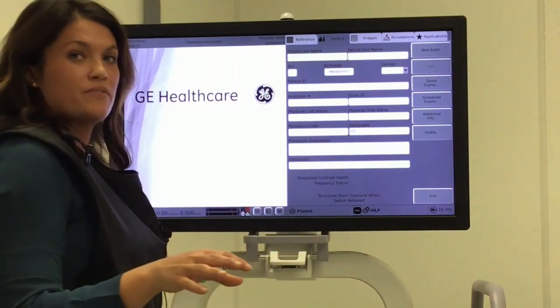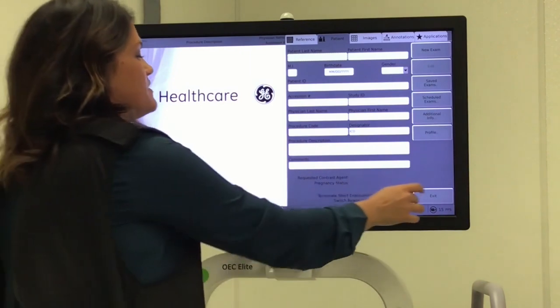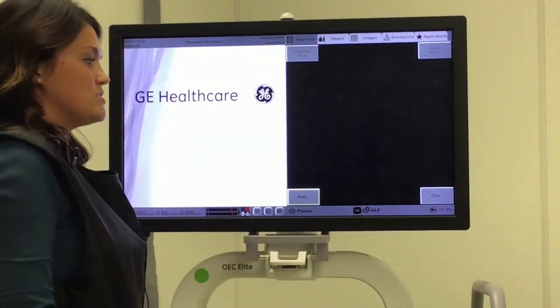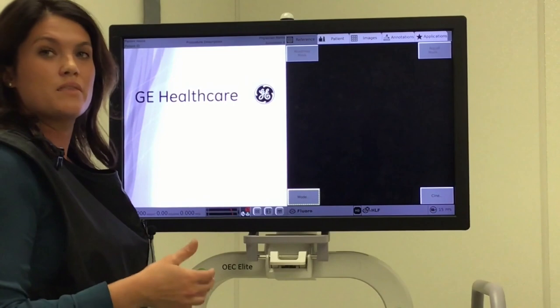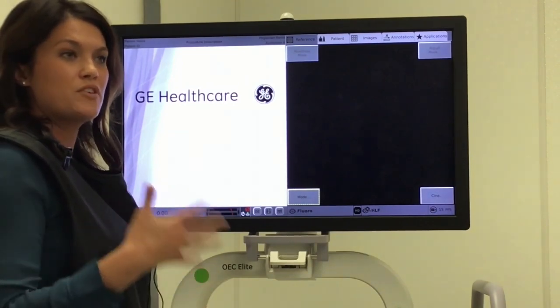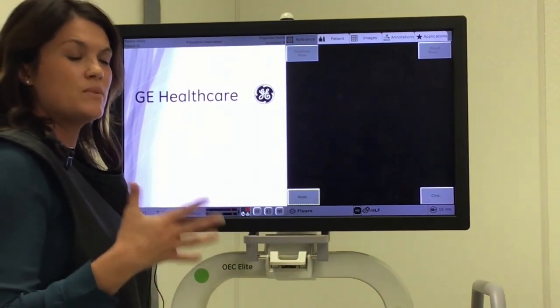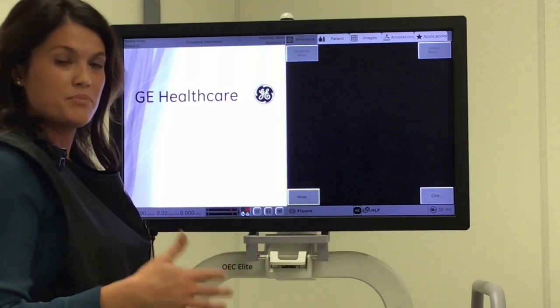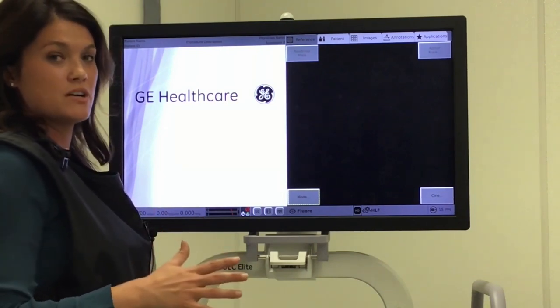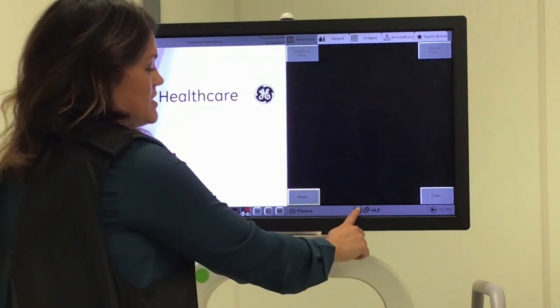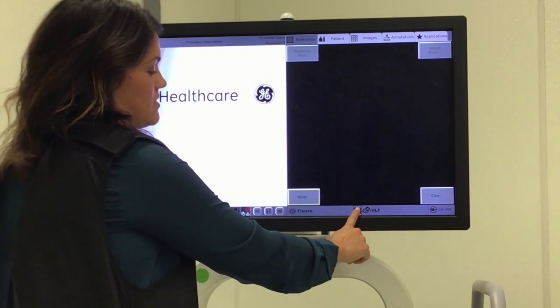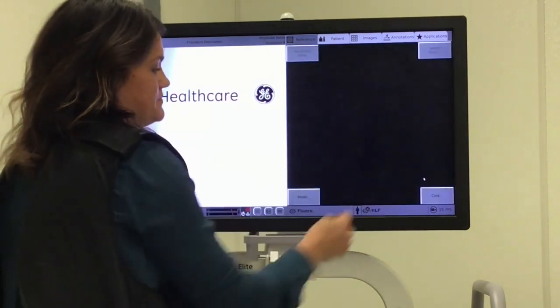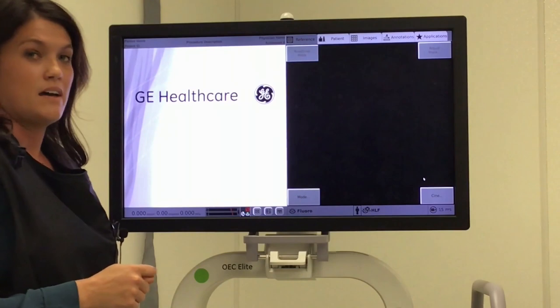Another way you can change your profiles is if you've already started your case and your doctor just isn't happy with the way the image looks. One of the first things I do is change my profile before I make any sort of brightness or contrast changes. Simply touch the icon and change the profile.